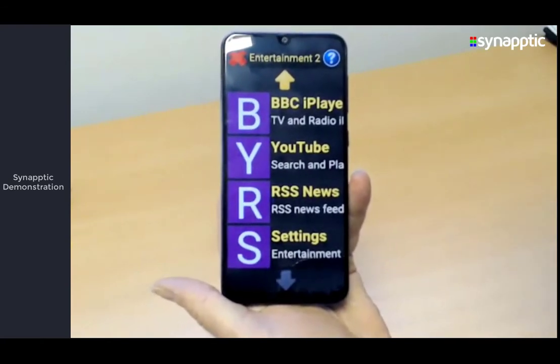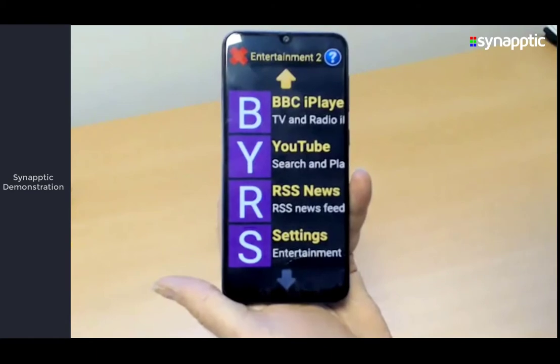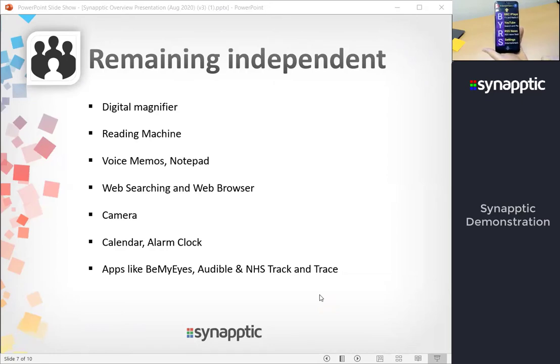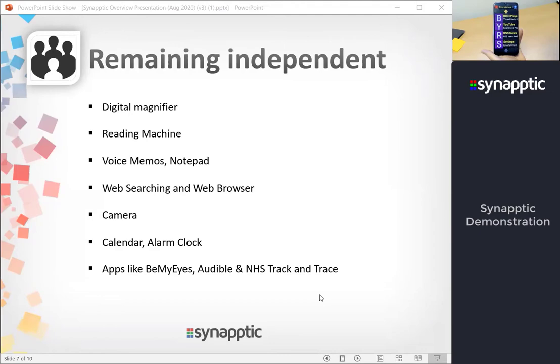That's the entertainment features. We'll move on lastly to features for remaining independent. This includes things like our digital magnifier, the reading machine, voice memos, notepad, web searching and browsing for online shopping or finding information, calendar, alarm clock, and access to apps — things like Be My Eyes, Audible, and the NHS track and trace app. We'll have a look at the magnifier, reading machine, apps, and web searching. Most of these are in the toolbox menu.